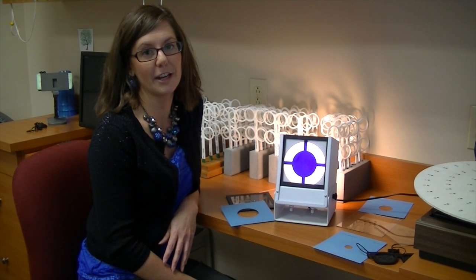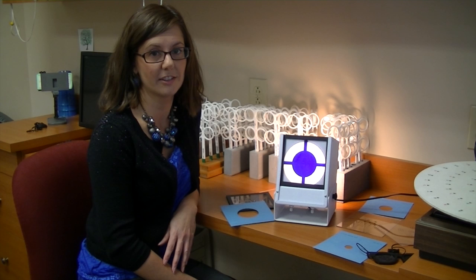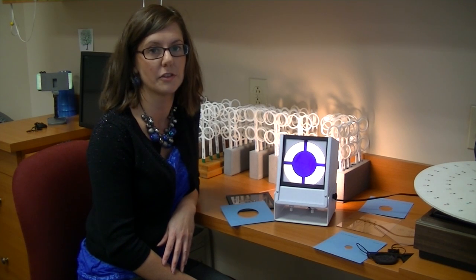Hi, I'm Dr. Julie Steinauer, and today I wanted to show you one of the fun but challenging activities that we utilize in vision therapy.